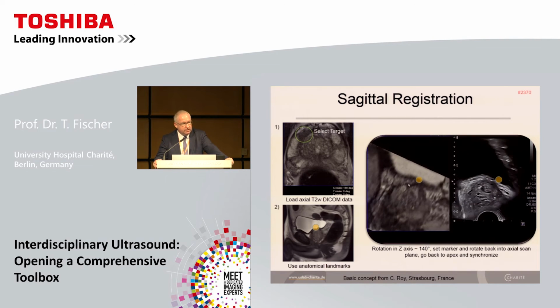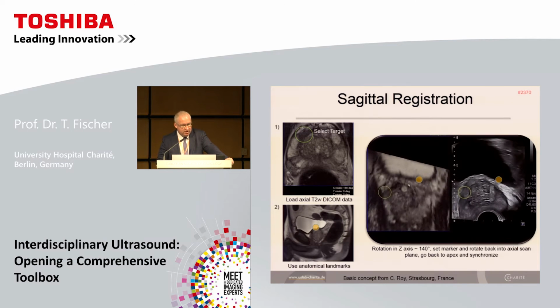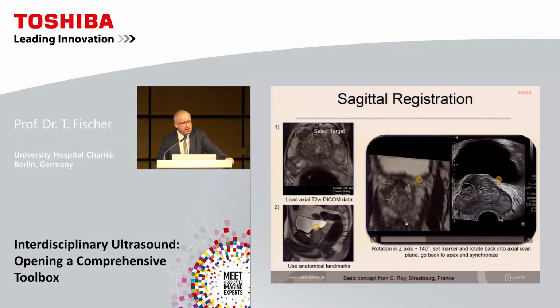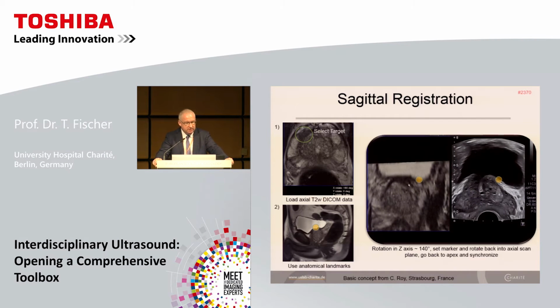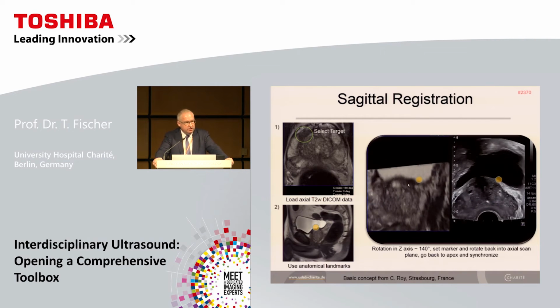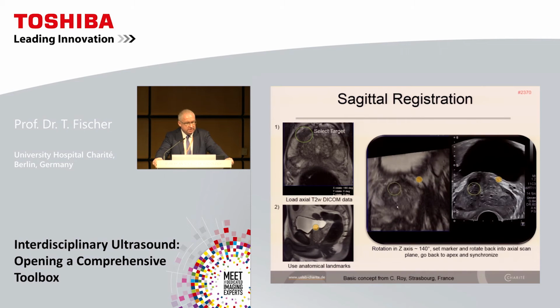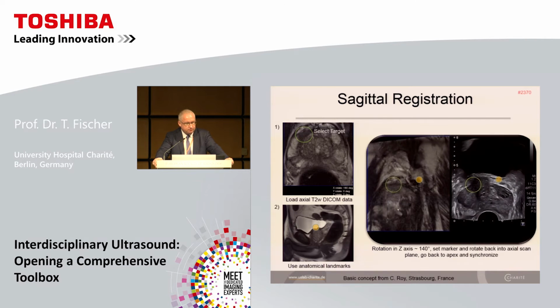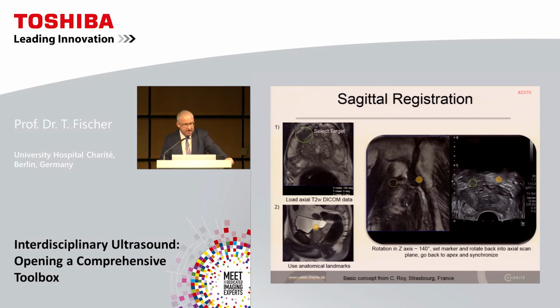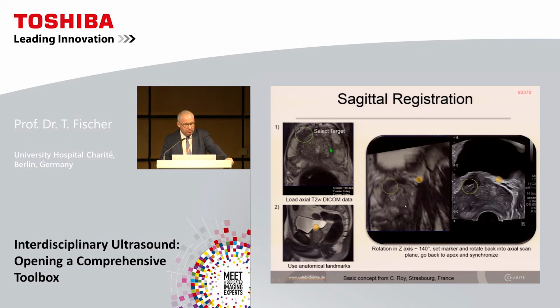You see it here. Then look on your left on the MR scan, go back to the apex of the prostate, focusing only on the apex of the prostate to have a clear orientation, a perfect alignment to ultrasound. Switch to your set button, fix your image, and then move on to ultrasound. You see it here. We are on the apex. We're fixing the MR imaging.